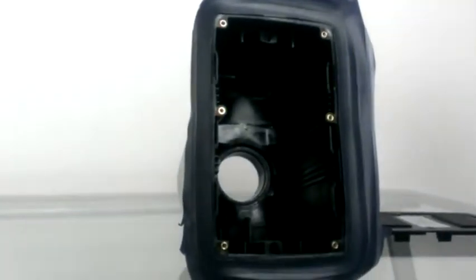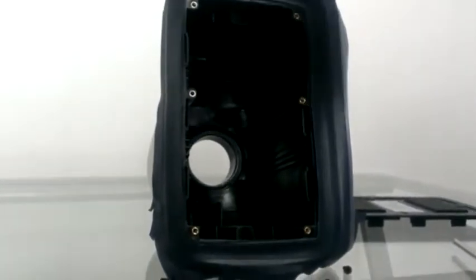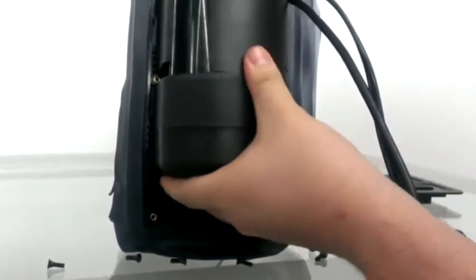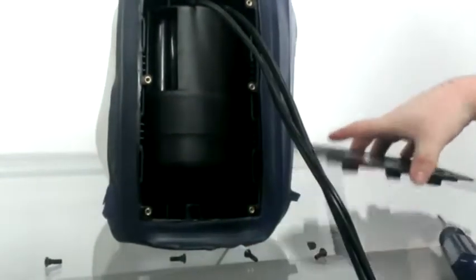This is the inside of the pump. Get your new pump and place it right back in. The channels will line up with the middle screws, as you can see. Just push that back into place, making sure it's sealed all the way so that the air is sealed in there.